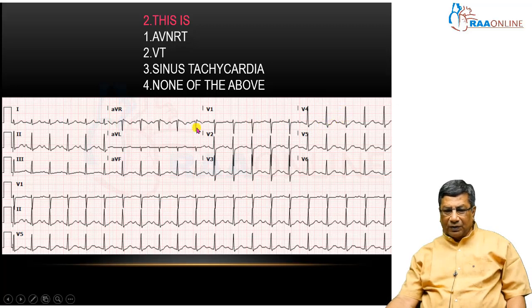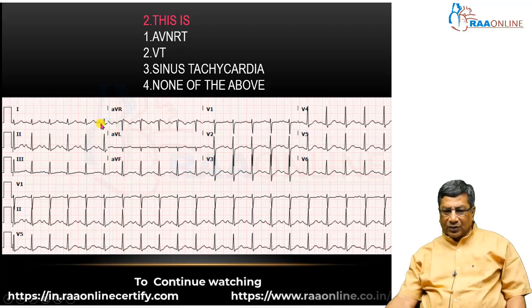Once you have a P wave in front, look at lead 1, which is upright, aVR, lead 3, and it is biphasic in V1. So the configuration, width and duration of the P wave look like sinus. Although it is preceded by the QRS, the P wave is crucial. The P wave looks like sinus, so this is likely to be a sinus tachycardia.